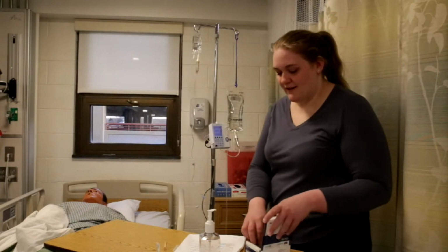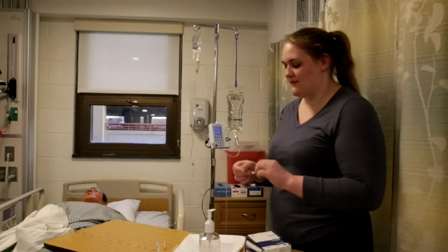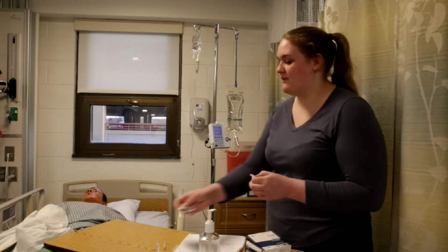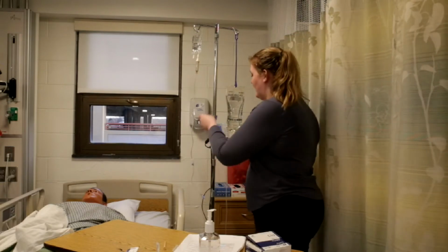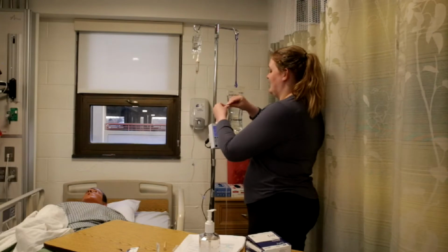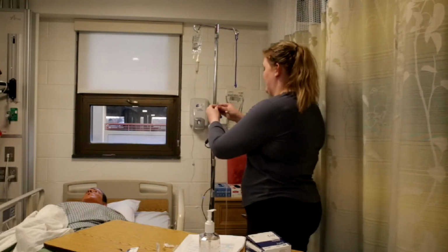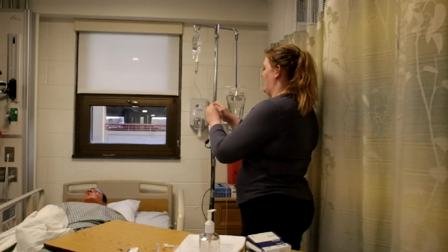Okay, so now I'm going to take an alcohol swab so that I can scrub the site that I'm going to be putting the piggyback tubing into right here. So we're going to scrub this for a good 30 seconds. That was 30 seconds. Making sure that we're keeping everything clean.